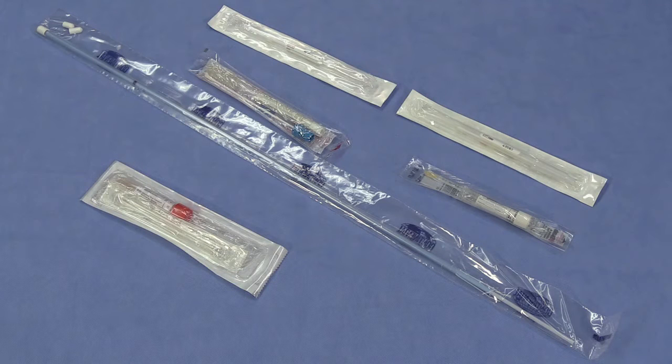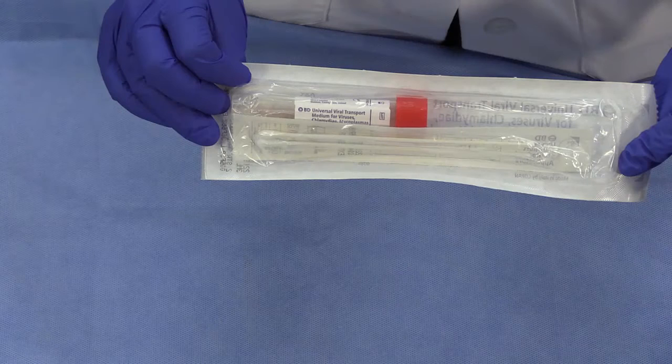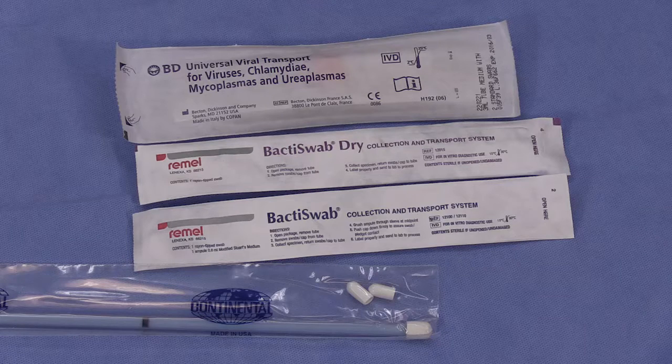There are many commercially available transport systems. They supply both a swab and the transport media. These supplies are designed to be used together. The type of swab used to collect a sample is important.